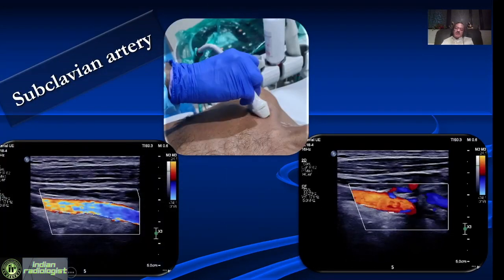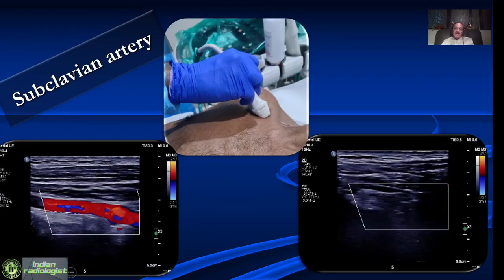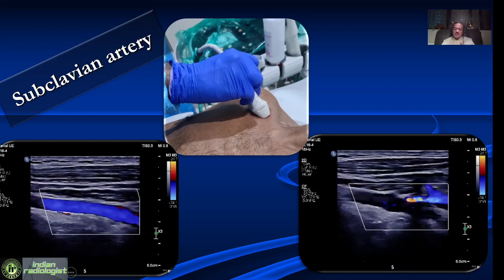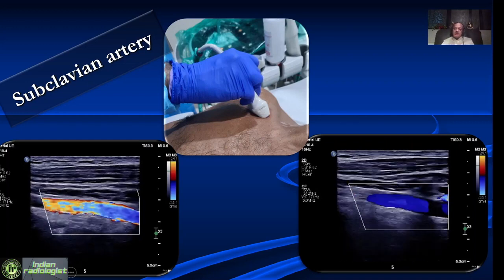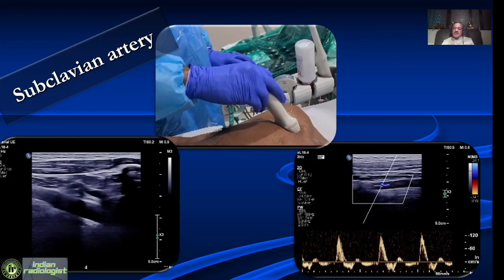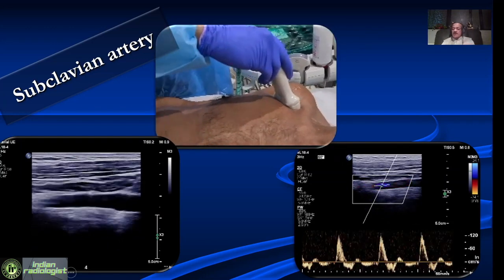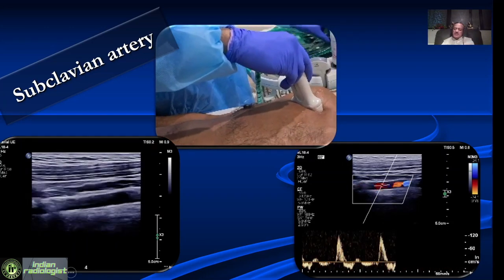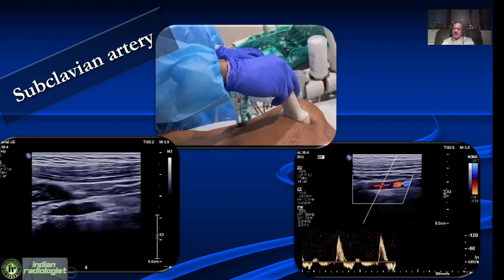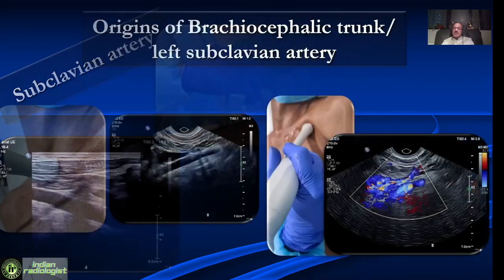Then, keeping the position the same, we look at the subclavian artery. Typically, we try and go as close to the aorta as possible and tilt the beam towards the manubrium sternum in the proximal position of the subclavian artery. As we go distally towards the axilla, we tilt the probe on the opposite side. The subclavian artery typically is a very high resistance artery with a reversal of diastolic flow, and you might get a little forward flow a little later — it is a very high resistance waveform.